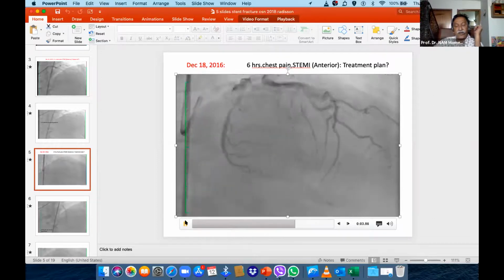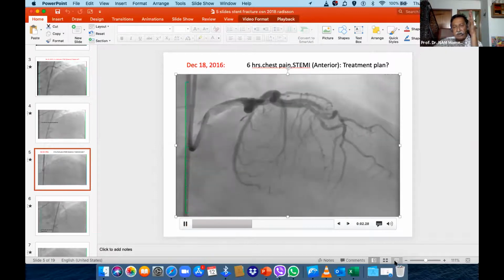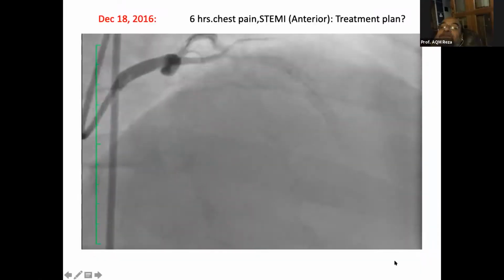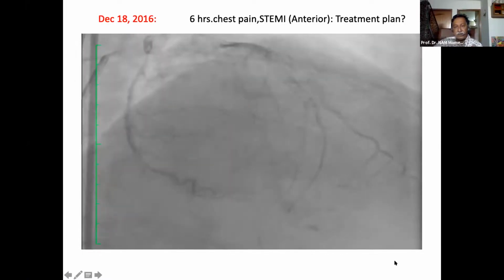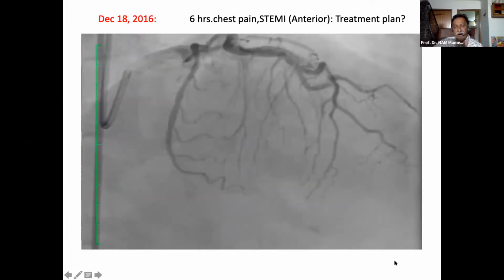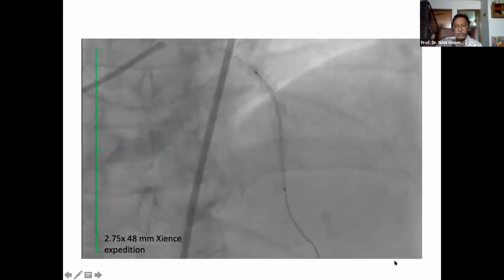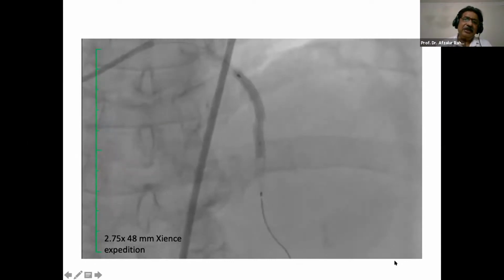Can you make a CT angiogram of this patient? Because I am in doubt that the distal segment could be in the aneurysmal segment. The problem is the LAD is not seen distally, before or after the stent. So how was it dislodged, malaligned like this? No, not really malaligned. There should be space.